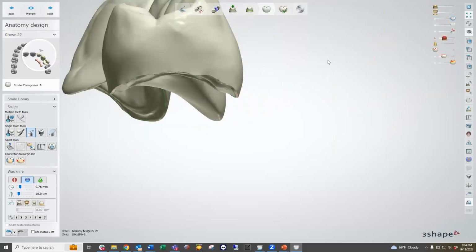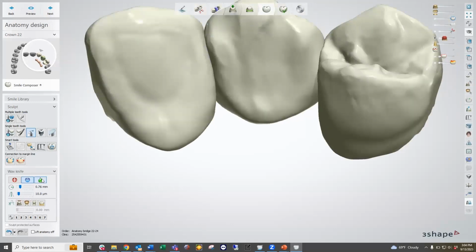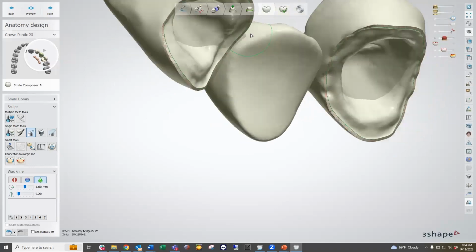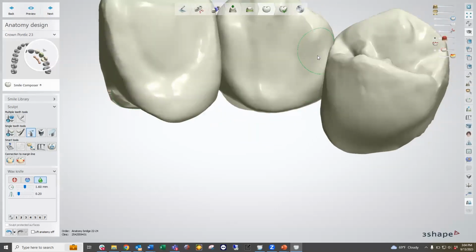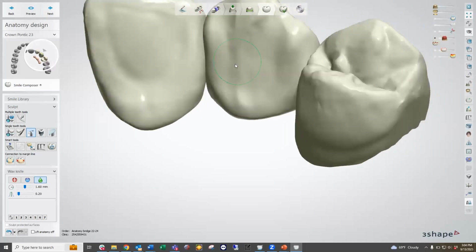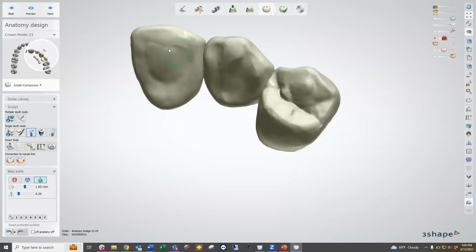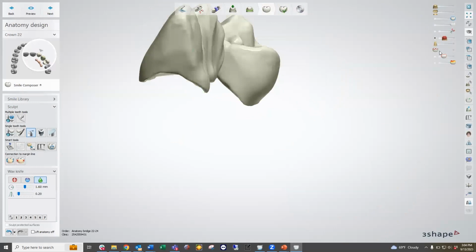Okay. So once we have our design looking good, we know that it meets the minimum thickness because I don't see anything coming through. Now what we're going to do is take a look at how these units are, again, touching the interproximals. With the pontic, the interproximal is just going to be our neighboring units. So as long as we're coming into contact and not coming through the tooth on either side, you should be fine. So this looks fine. As long as I don't see any daylight coming through, I know that I have a nice solidified contact between those two areas. But for the teeth that are touching neighboring teeth, like our lateral here, we're going to turn on this feature again, which is under our wax knife.